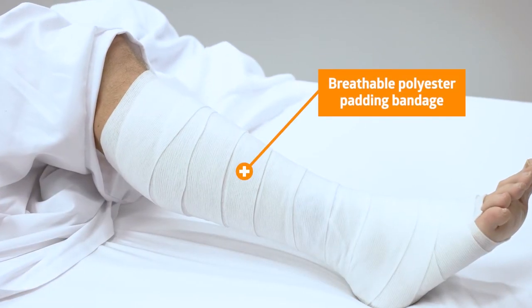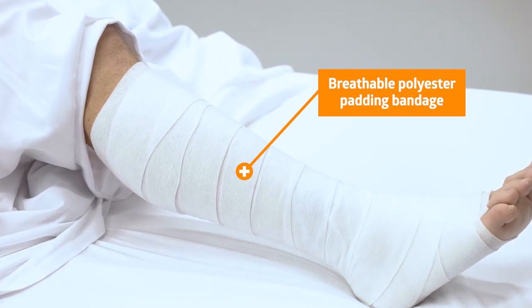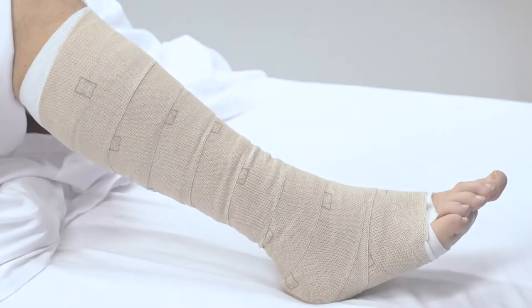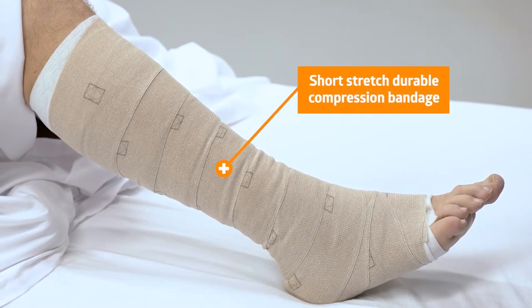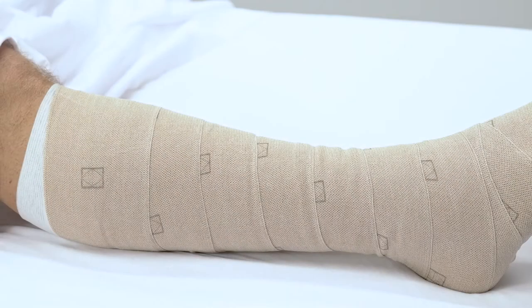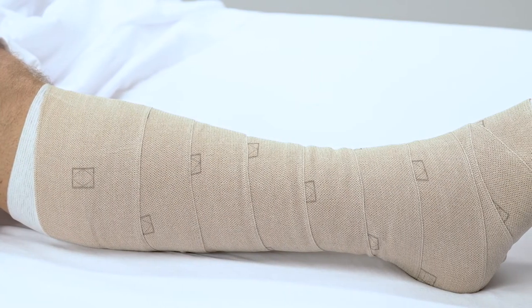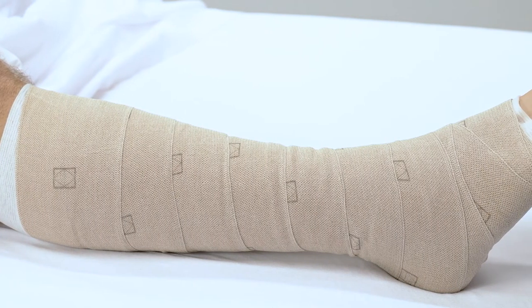ACCURAP's first layer is a breathable polyester padding bandage that offers comfortable moisture management. The second layer is a short-stretch durable compression bandage that delivers therapeutic levels of compression. The second layer has accuracy indicators printed every three inches on the bandage to help ensure the bandage is applied correctly.